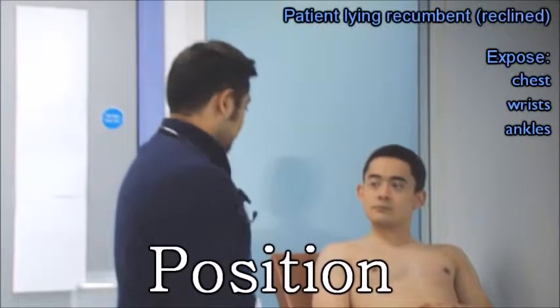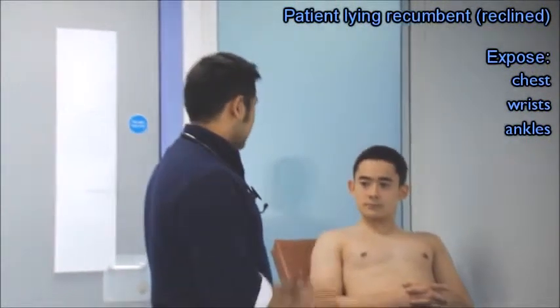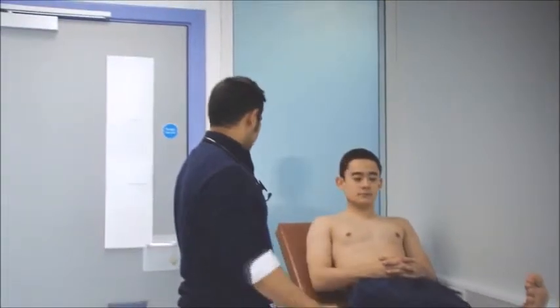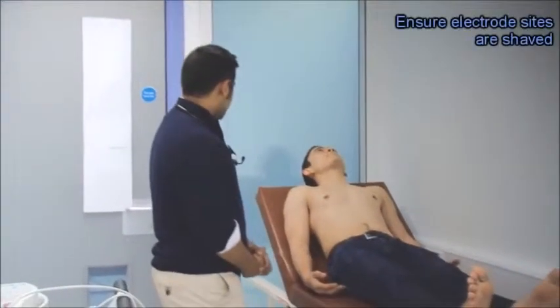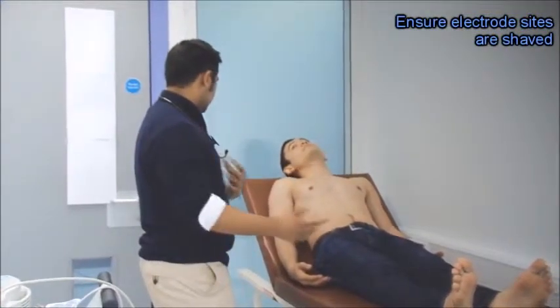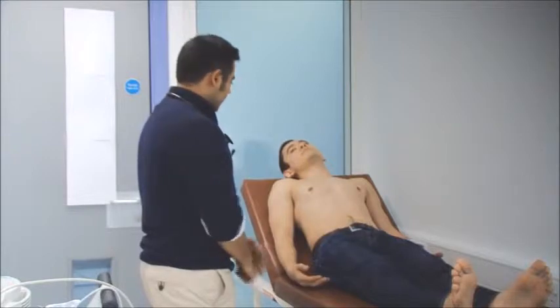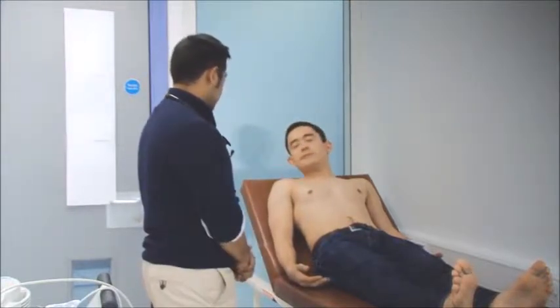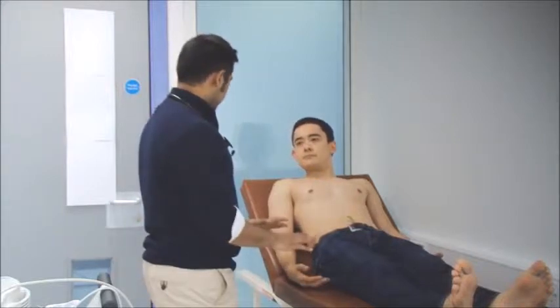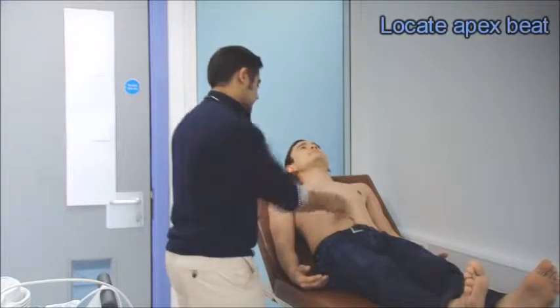Okay, so like I said, the procedure shouldn't take longer than 5 to 10 minutes. And for this, I'd like you to be as relaxed as possible. So just be as loose as possible. And just before I begin, has the nurse come and shaved your chest and your ankles? Yeah, okay. And have you got any pre-existing conditions of your heart that I should know about? No, you haven't at all. Okay, so you're comfortable at the moment? Okay, so before we begin, I'm just going to quickly have a feel for the heartbeat.